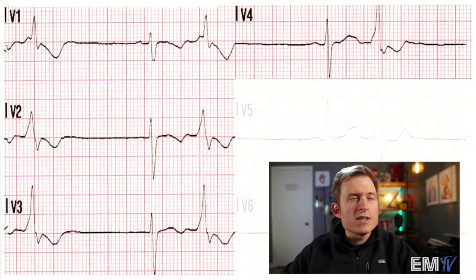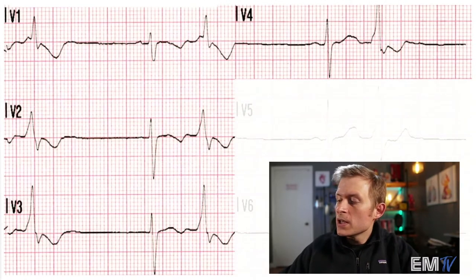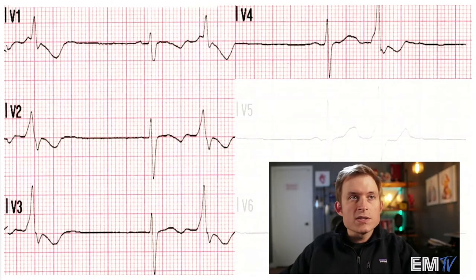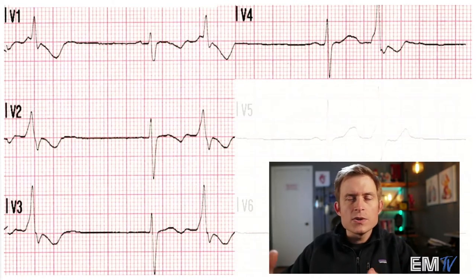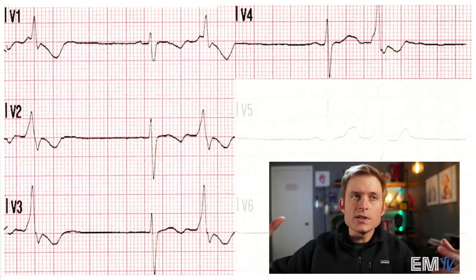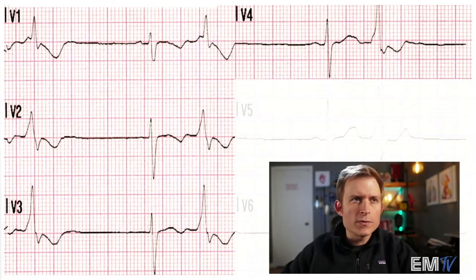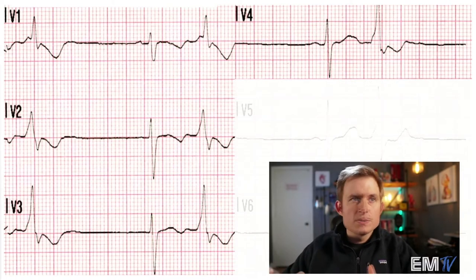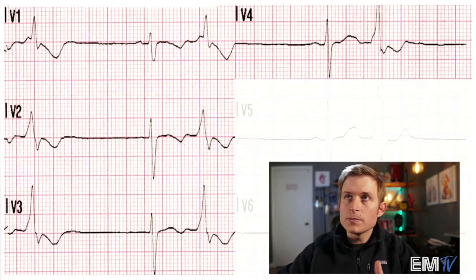Quickly looking at this, I'm not seeing any ST segment elevation in our actual sinus beats. When you're interpreting a 12-lead, you're looking for ST segment elevation in your normal beats, not your ectopic ones. You don't need to interpret the PVCs on a contiguous lead grouping interpretation — they're not going to be diagnostic for STEMI. What you're looking for are your sinus beats, and you base your interpretation on those.